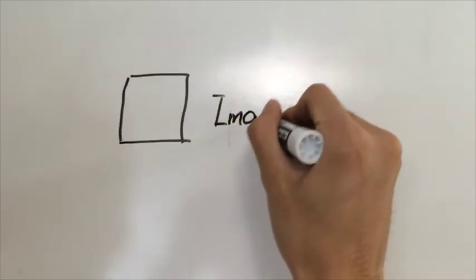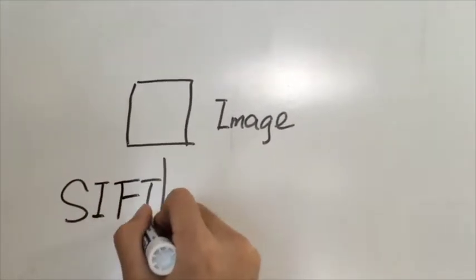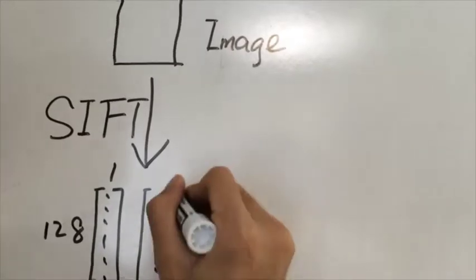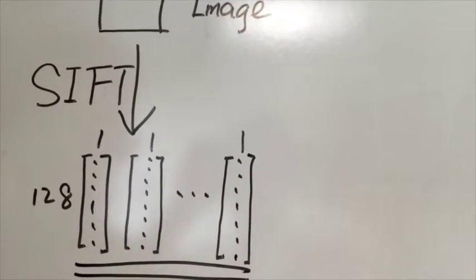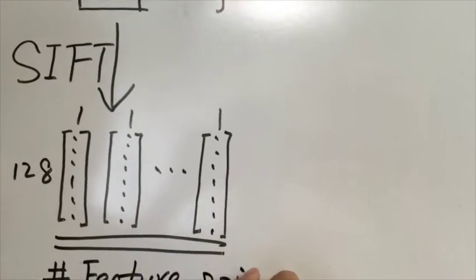In terms of algorithm, the major methods being used here are SIFT, K-means cluster, and support vector machine. Given a single retinal image, the first thing we do is to apply SIFT to obtain feature vectors of dimension 128 by 1. Depending on the complexity of the image, a large number of feature vectors might be generated.